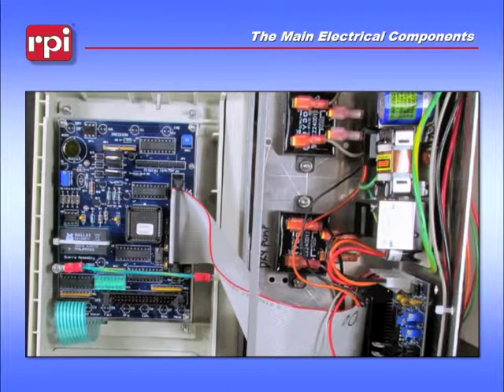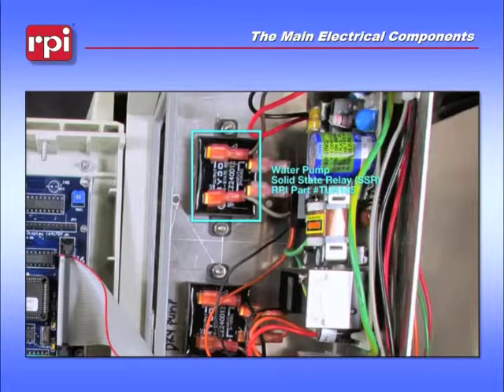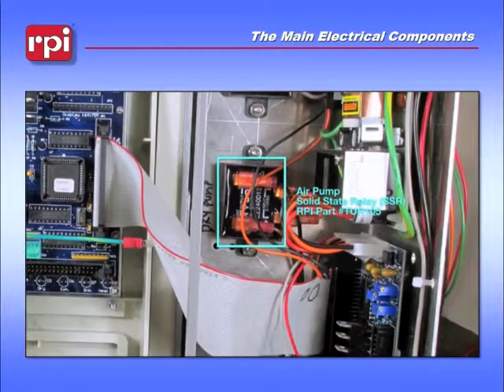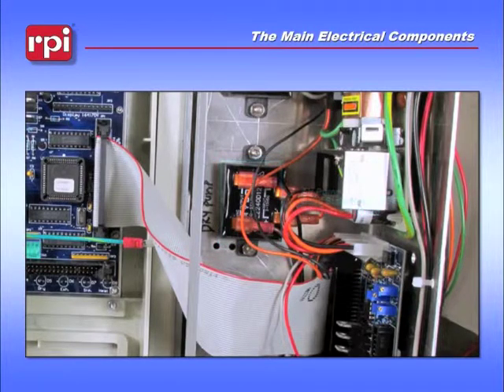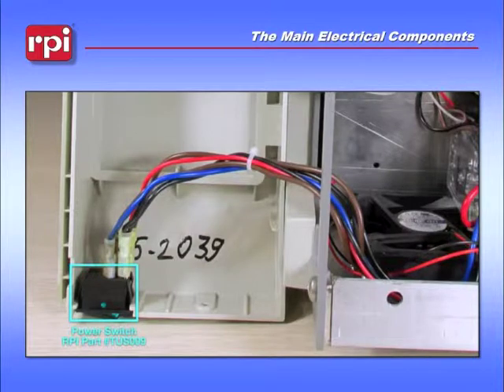Moving over to the right inside the cabinet, on the top, is your solid state relay for your water pump. Just below that is the solid state relay for your dry pump or air compressor. Moving over to the bottom of the plastic portion is your power switch.